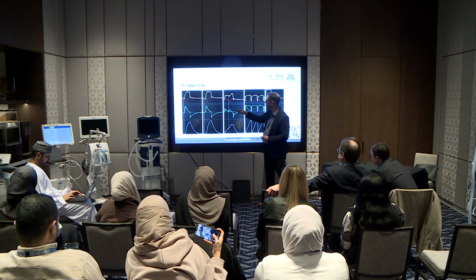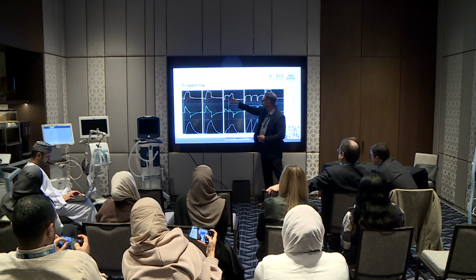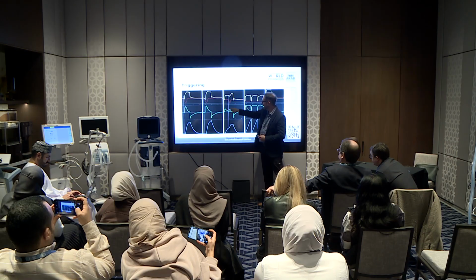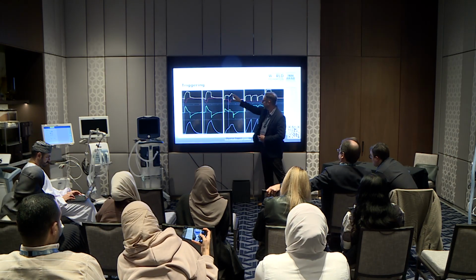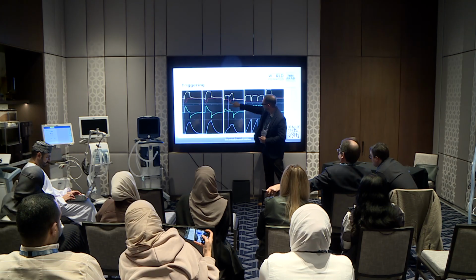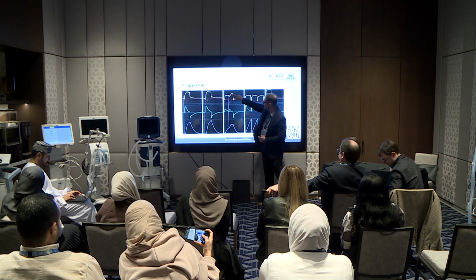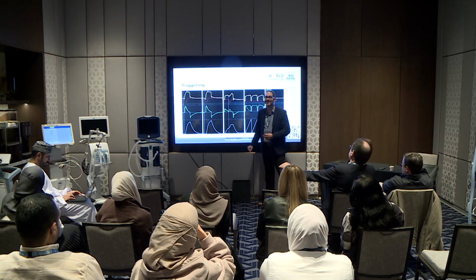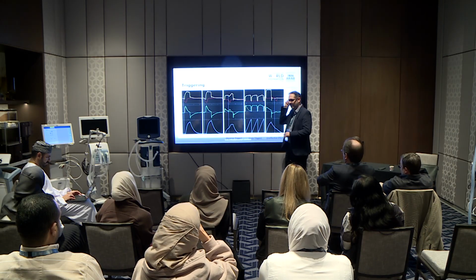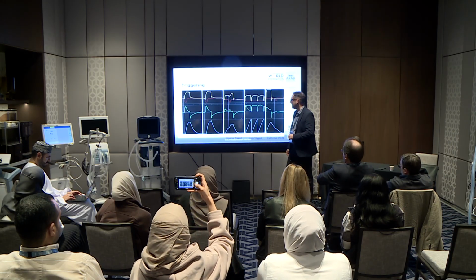This is a pressure control mode, I can tell, because pressure is straight. They make the effort here, and they get more flow, and then the pressure goes up because there's a pause here. This is the elastic recoil of the lungs. See how the patient's relaxing here? It's demonstrated here, and then it finally cycles off. So this is reverse triggering, but also delayed cycling, which I'll talk about. This means the ventilator is taking too long to cycle off.